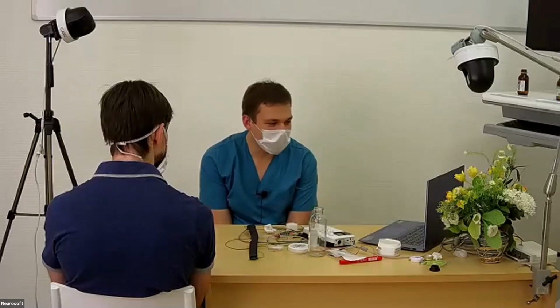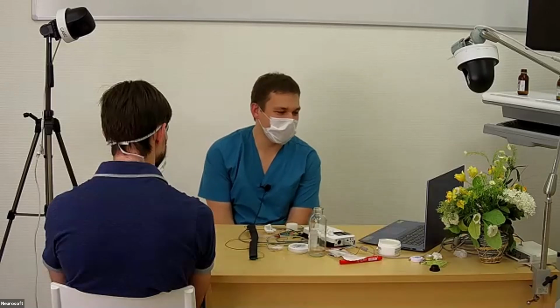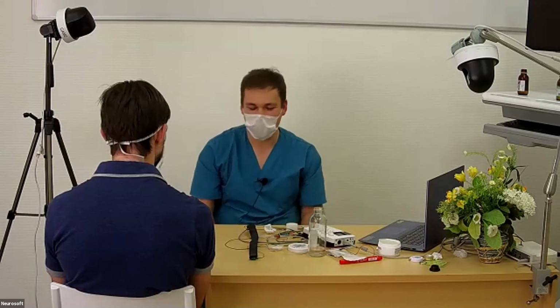As I see, we made a very great job because we have only a few questions. I have a question. Why, Evgeny, did you ask Michael to count down in the T-reflex? Because he can inhibit cortically; he can inhibit all tendon reflexes. To release the reflex, right? Yes.